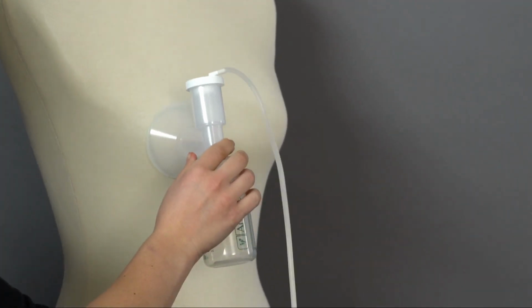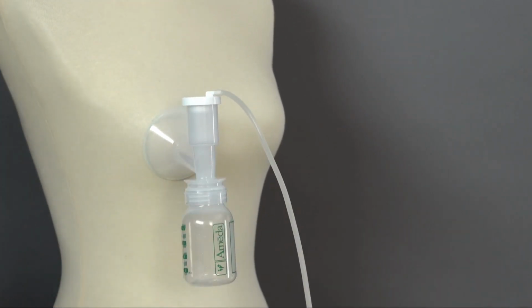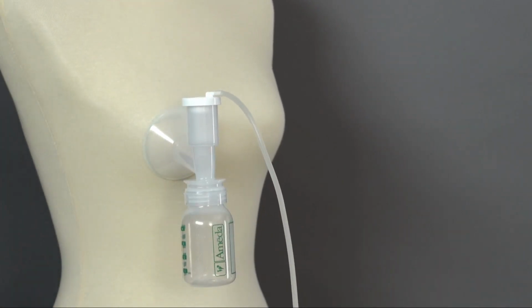Ensure proper fit. Center the flange on the breast to create a seal. Press the power button to turn on the device in stimulation mode. You can adjust the stimulation vacuum level between 1 and 6 to your preferred comfort level.